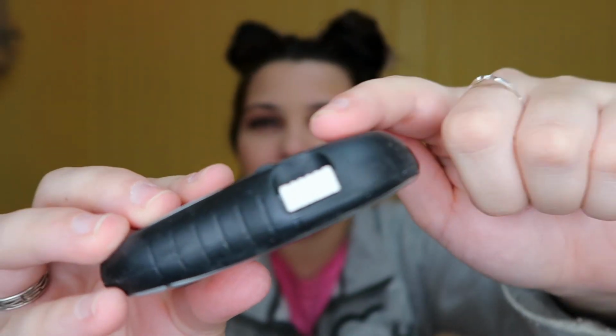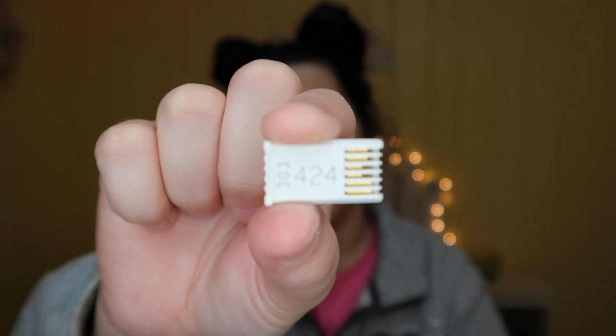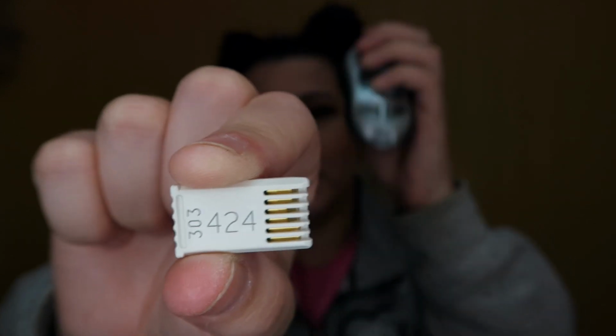Then let's see what's in this case. I told you I had another one. I told you. Then actually, I think this was the first meter that I ever used straight out of the hospital, and this is a throwback. This is the Accu-Chek Aviva. This meter had this little slot right here, and what was in here was a little card, and this little card was how you activated the test strips. So each bottle of test strips would have a number on it, and you would have to put the chip into the meter so that you would have accurate blood sugar readings. I had forgotten about that.